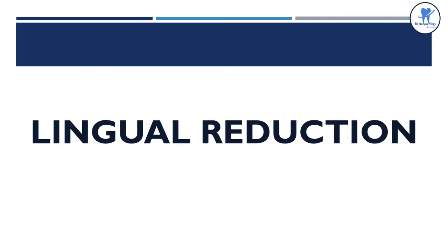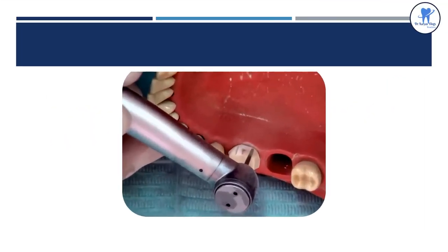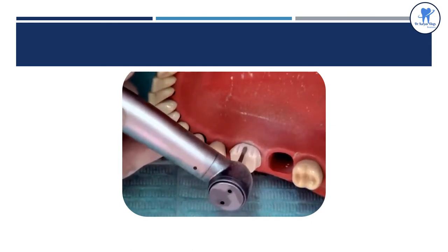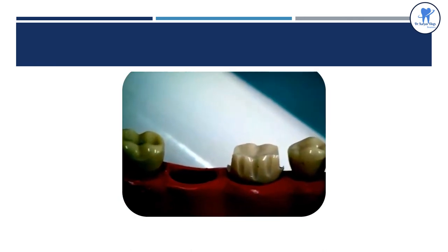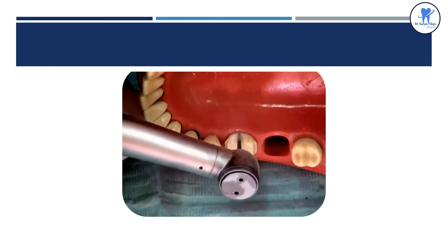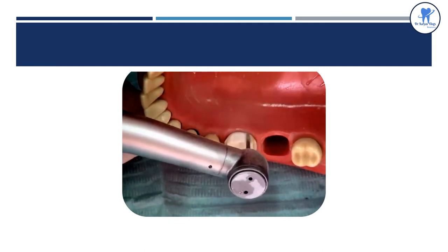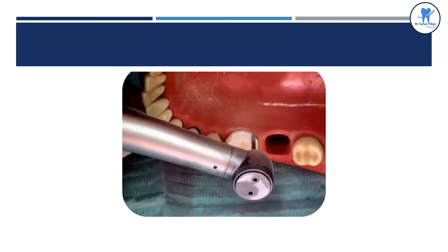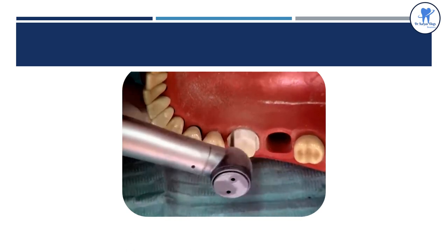A similar procedure is used for preparing the lingual surface — that is, lingual reduction. In the lingual reduction video, grooves are placed and the preparation is done. Note that the chamfer finish line is very clear.